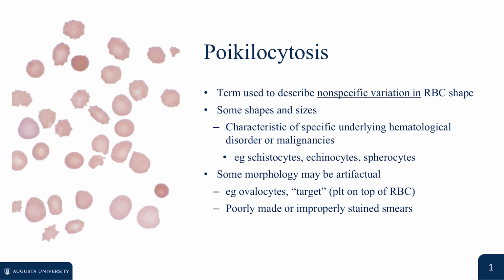Welcome back to Clinical Hematology Reviews. Today we'll be discussing RBC poikilocytes. Poikilocytosis is the general medical term used to describe a nonspecific variation in RBC shape.